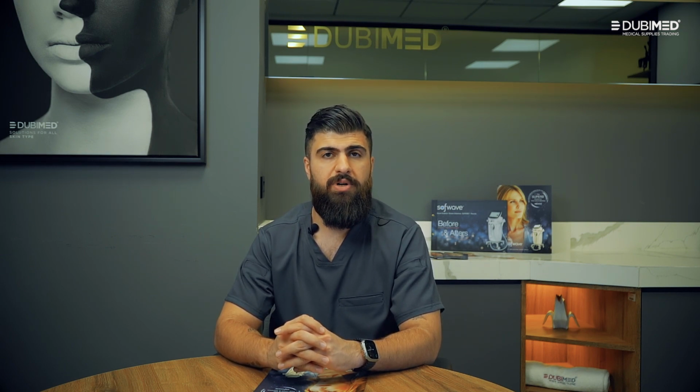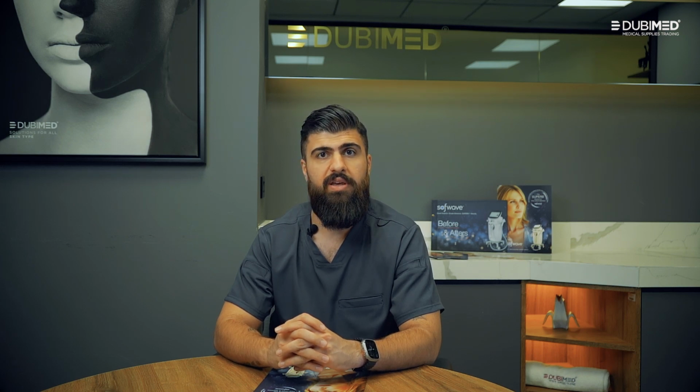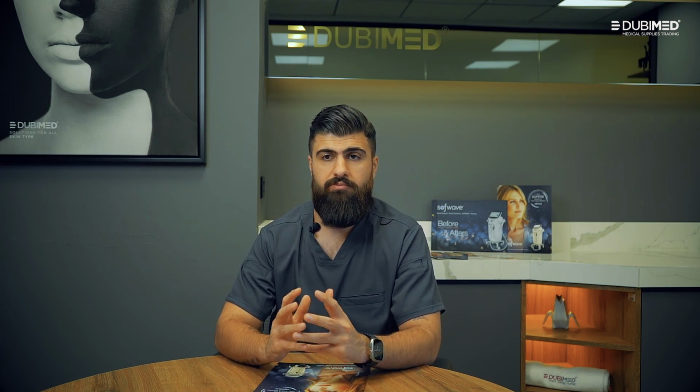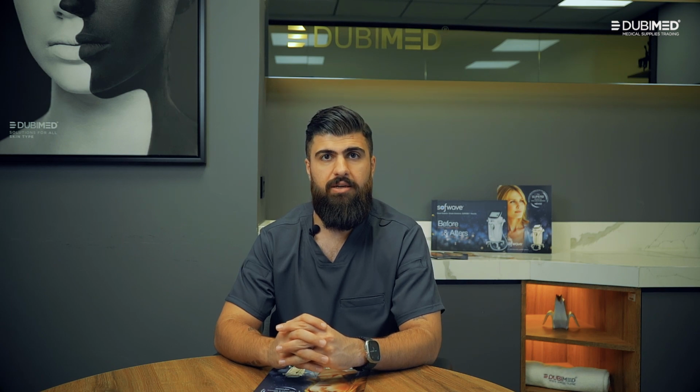Now, we are not going deeper than 1.5 because most of the new collagenesis is happening in the mid-dermis at the depth of roughly 1.5 millimeters. So there is no need to go deeper because we want to reduce the chances of damaging facial fat or creating fibrotic tissue under the skin.